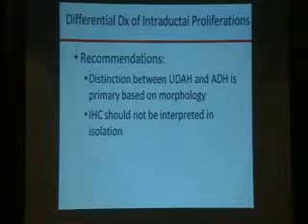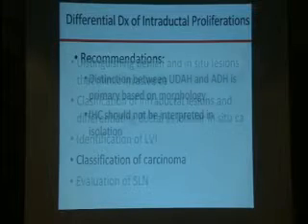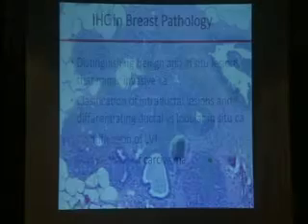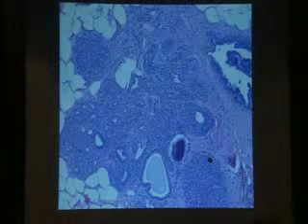So in general, for the classification of intraductal lesions, distinction between hyperplasia without atypia and ADH is primarily based on morphology, but in isolated cases it can be used. Another application is, as I indicated before, classification of carcinoma.